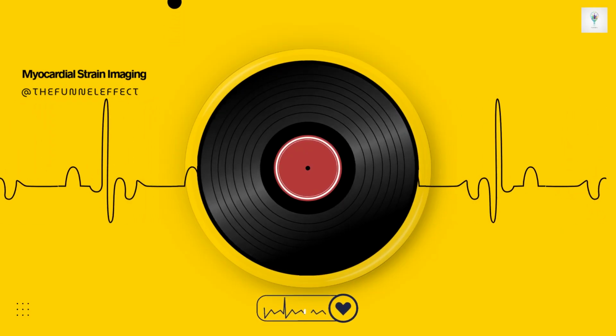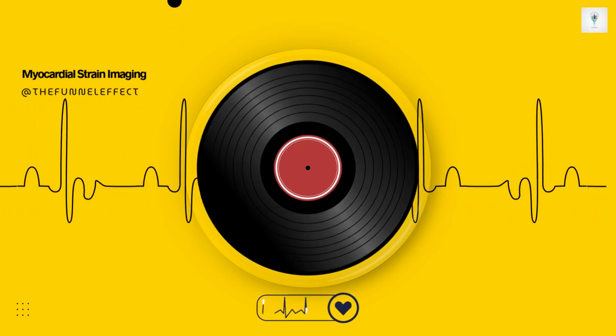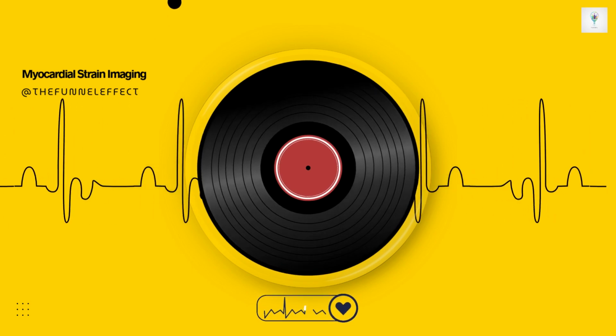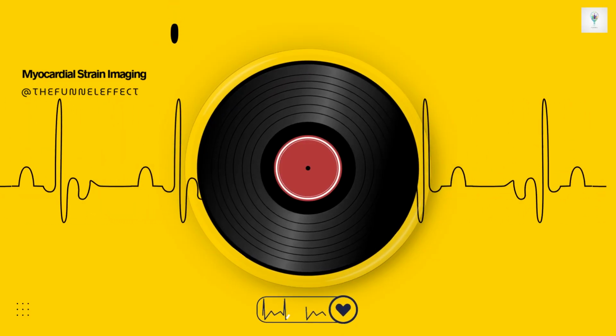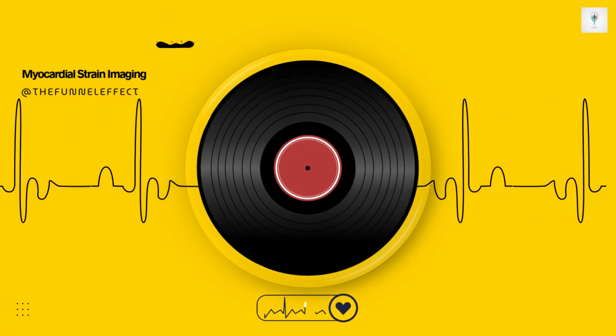How disproportionate? The data cited in the review suggests that circumferential shortening contributes about 67% to the stroke volume, while longitudinal shortening contributes only about 33%. Wow, 2/3 versus 1/3. So LVEF is mostly measuring the squeeze around the middle, not the shortening from end to end. That's the key takeaway. LVEF is predominantly a reflection of circumferential function.